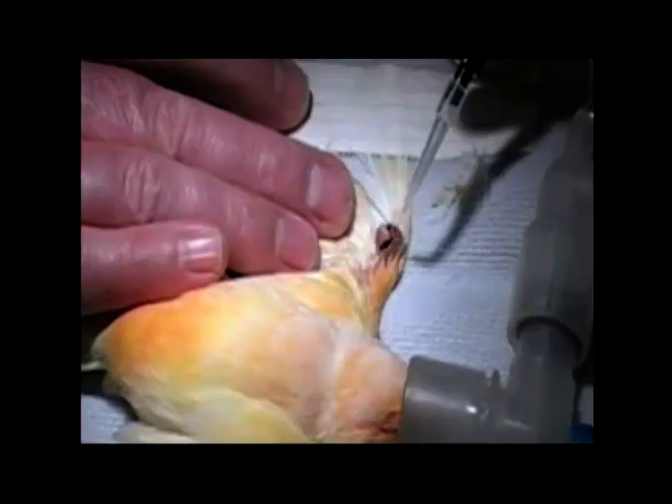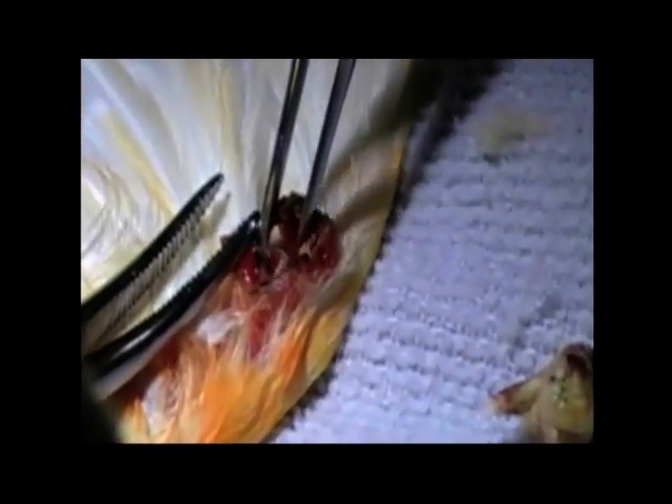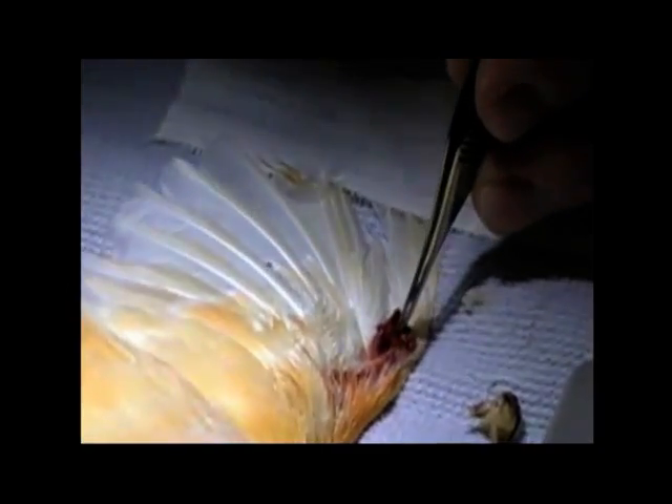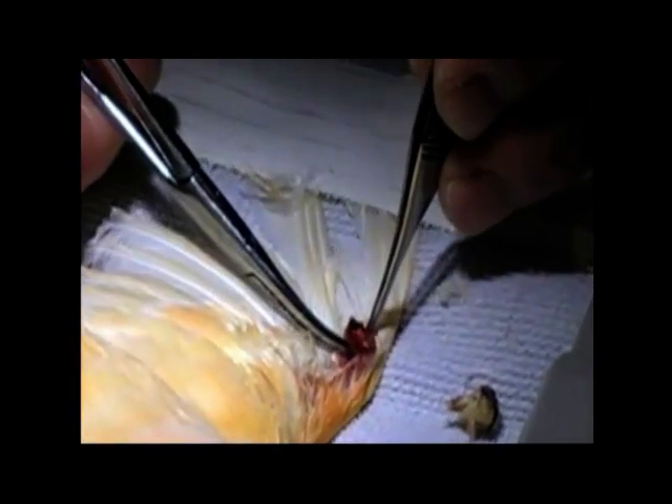This prevents any bleeding from occurring. You can see there's a little bit of smoking out of that incision I just created with that laser, so I'll be able to get that out. Then I've got the remnant in there of the origin. I'll stand off a little bit distant with my laser and just see if there's another portion of a cyst.